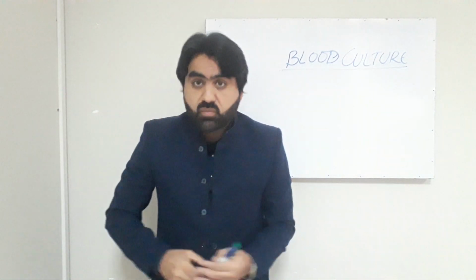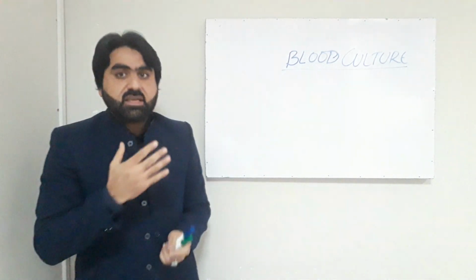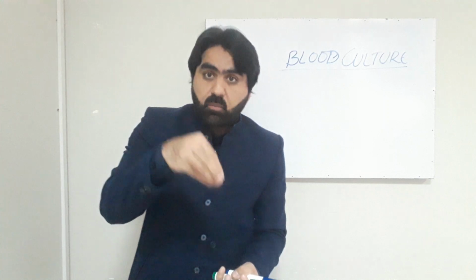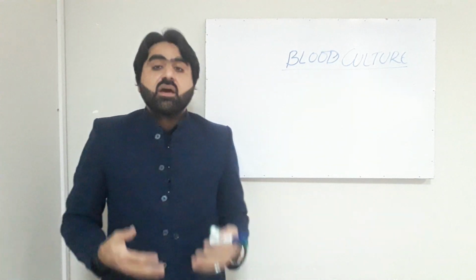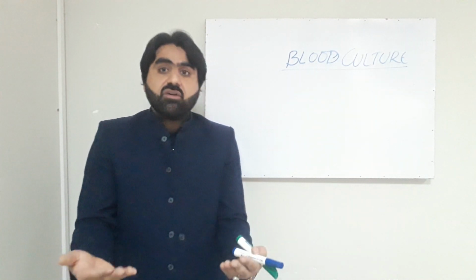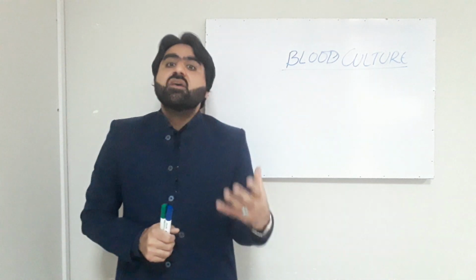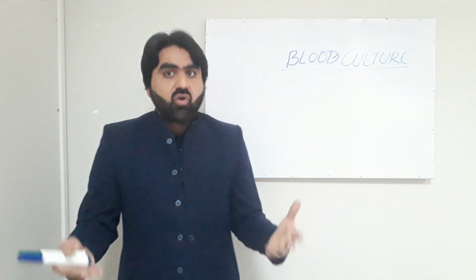We are going to discuss the blood culture. So the question is, what do we mean by blood culture? Blood culture is a laboratory test in which we take blood from a patient and inoculate that blood into the media present in the bottle, in order to check for the presence of any microorganism responsible for the microbial or infectious etiology of that blood infection. These microorganisms usually include bacteria, but sometimes fungus may cause infection in the blood, in which case it is called fungemia.